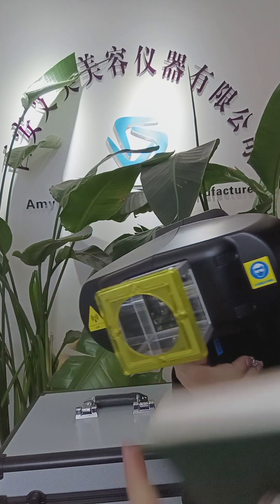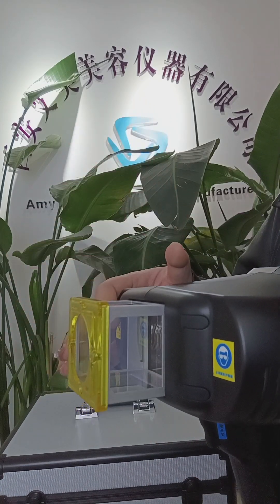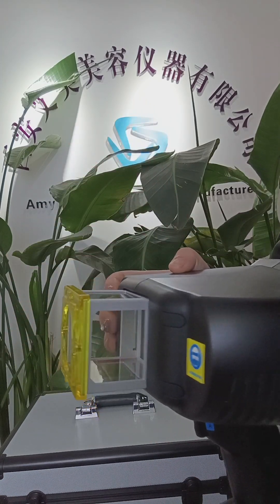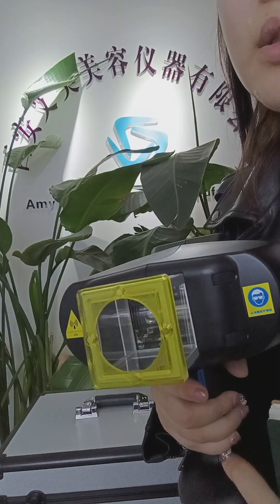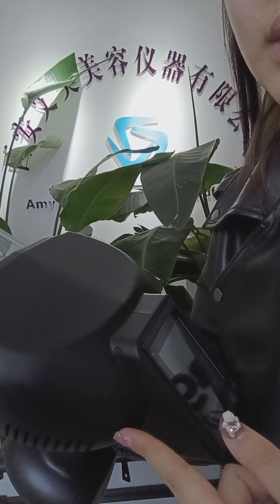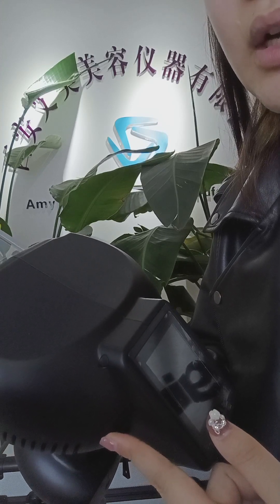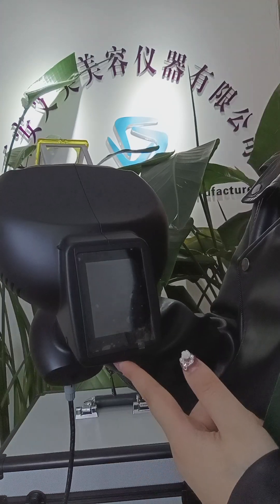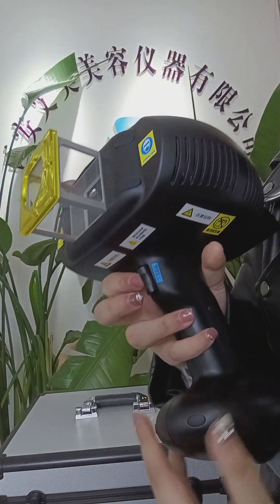When you use this machine, you need to put on the glasses, and your customer needs to put on the black glasses too. This machine is used to treat psoriasis, vitiligo, and allergic conditions. If you are interested in this machine, please contact me anytime. Thank you.